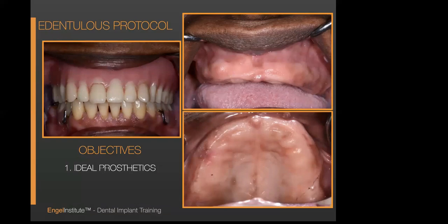You should use this. Now, I want to reiterate, if you're changing the VDO 3, 4, 5, 6 millimeters, or you are adding teeth where teeth have broken off the denture, this is not the one that you want to use, okay? But if a case comes in to me like this, I'm going to tell you, out of everything that I do, this is one of my favorite 2 cases to accomplish. Out of anything that I do, and I only do surgery, it would be this, and then it would be an all-on bone reduction type surgery, which I'll show you at the end.